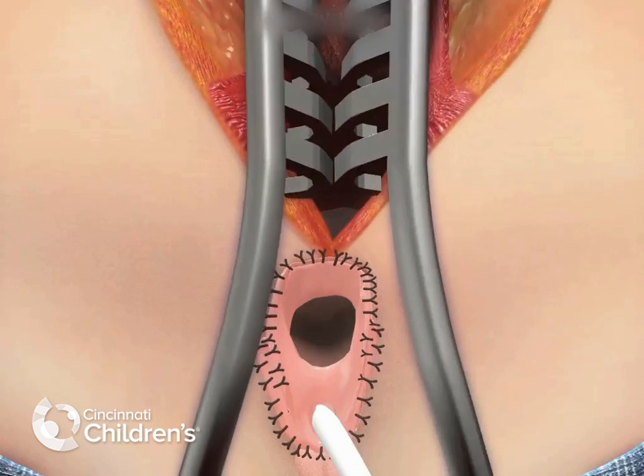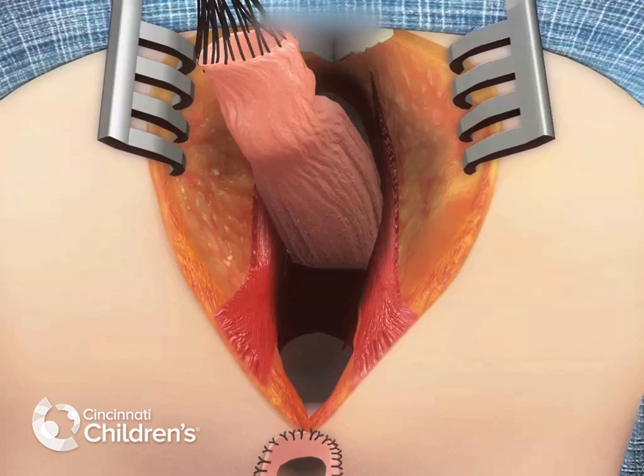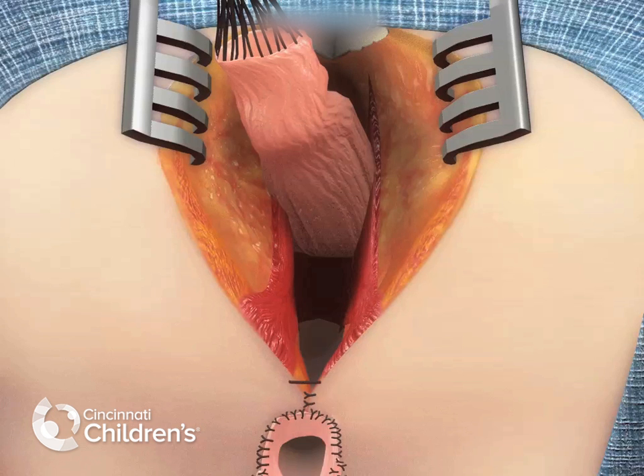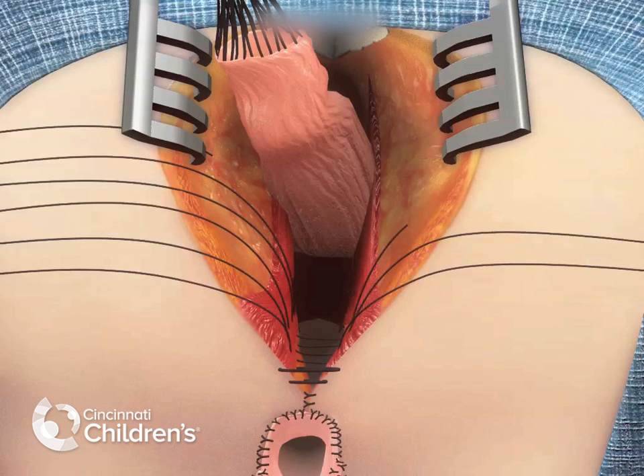At this point, the introitoplasty is complete, and the perineal body is closed up to the anterior limits of the sphincter. This is performed with multiple layers of long-term absorbable suture.